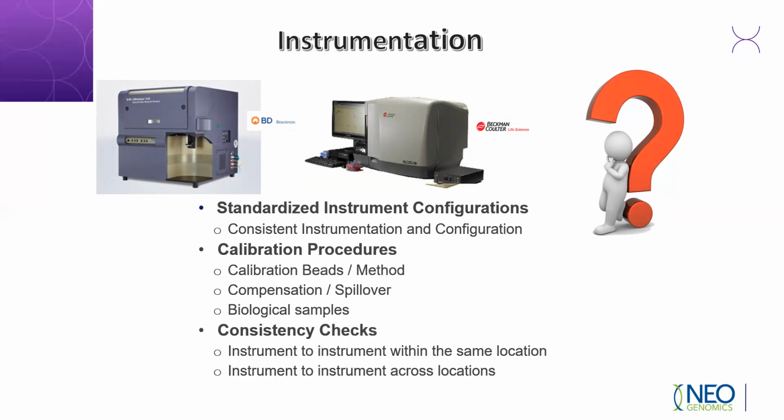It is possible to have different instrument platforms and have them perform consistently, but there will definitely be difficulty to align these outputs. It's not usually recommended to use different instrument platforms across different sites for this very reason.